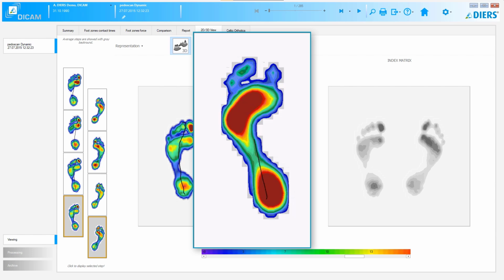In mid-stance, the COP maintains the direction taken and runs in a straight line towards the third toe in the direction of the forefoot. According to the lower ground reaction force, the longitudinal arch is clearly visible as a pressure zone, but does not show any pressure peaks.